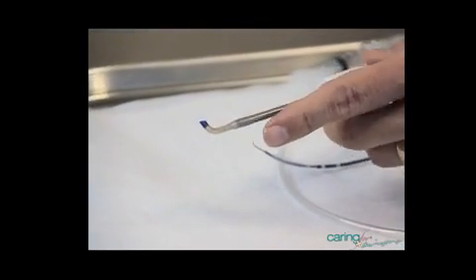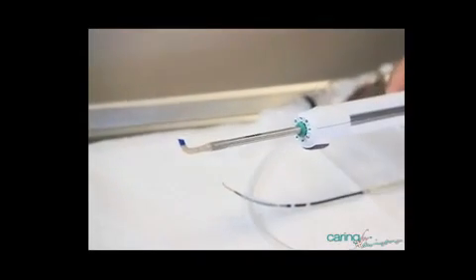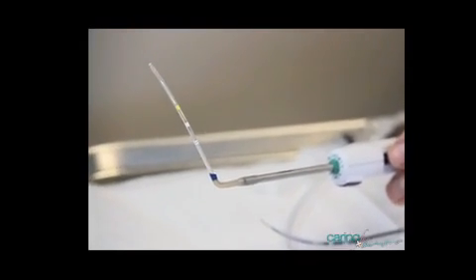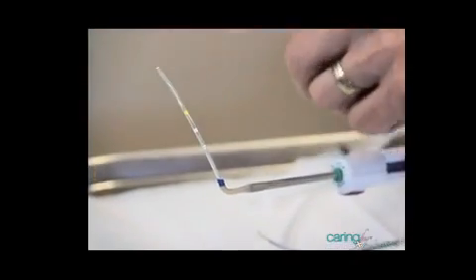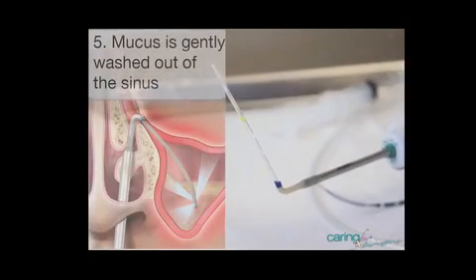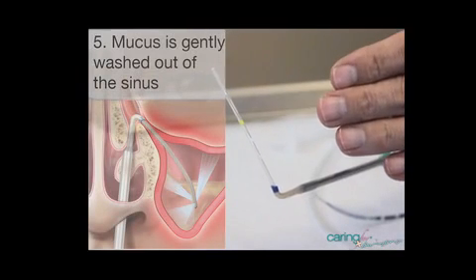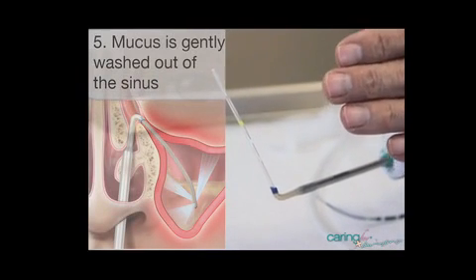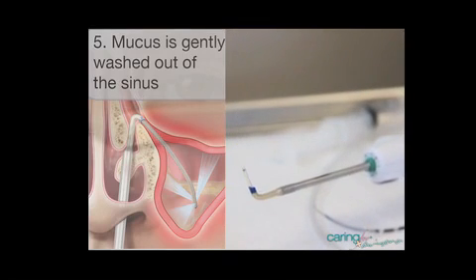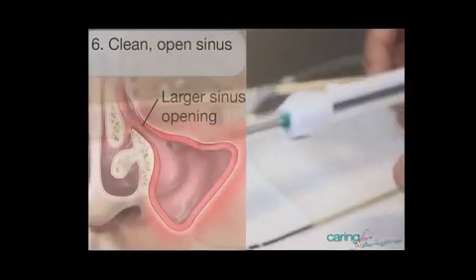And we have the sinus guide again that gives us a specific angle to enter the sinus. The irrigation device can be passed by itself or potentially with the guide wire in place to get it up into the sinus. We now can irrigate the sinus to rinse out any mucus or bacteria that would be present in the sinus, potentially adding antibiotic solution into this to sterilize the sinus cavity. Once that's completed, then we simply withdraw and remove it from the nasal cavity and the procedure is over.